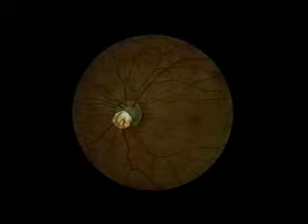Note the color of the optic disc, the clarity of its margin, and the size of the physiologic cup. Normally, the disc is yellowish-orange to creamy pink and round or oval with well-demarcated margins. It may be surrounded by white or pigmented rings or crescents. The optic cup to disc ratio is usually less than 1 to 2.